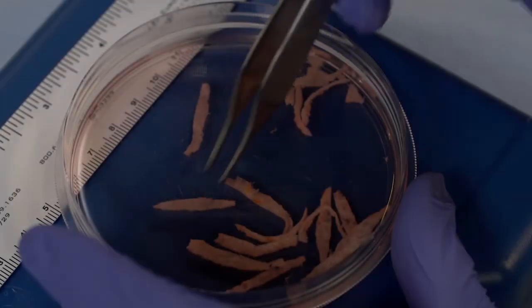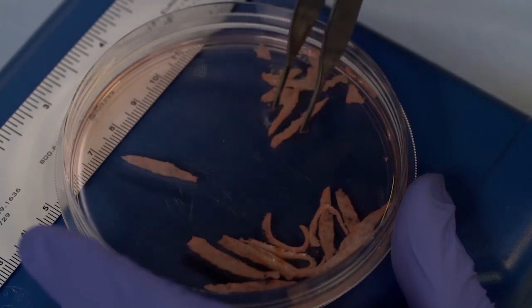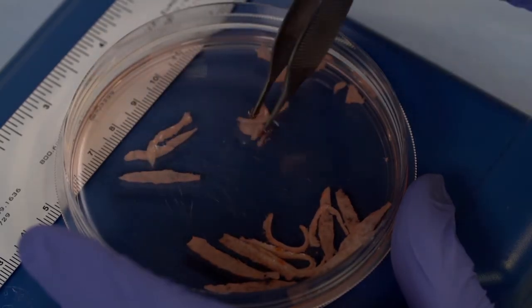Count the number of cortical strips and then divide the strips between patient use and research. Follow the Form 4 for additional research handling instruction.